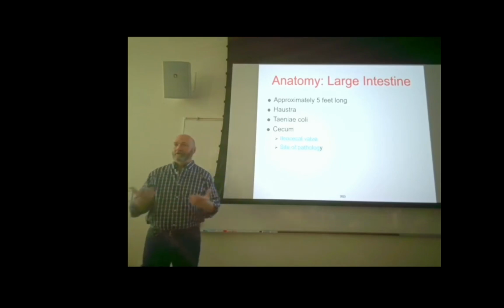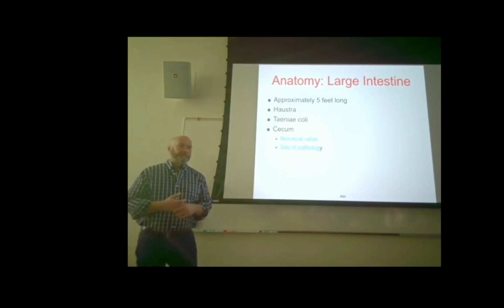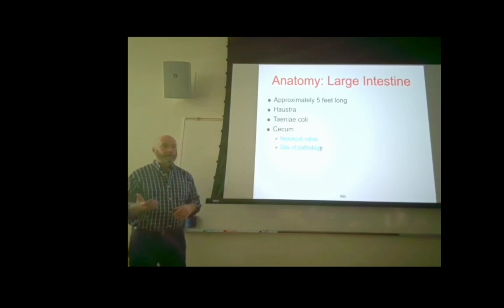Appendicitis can theoretically be diagnosed with some sort of colonic exam, like a gastrografin enema. I used to work in a hospital where it was routine. If a patient came in with suspected appendicitis, we would do a gastrografin exam. Now, why would we do gastrografin? What is gastrografin? It's iodinated, right? So why would we want to do gastrografin as opposed to barium? If it gets out of the body, it won't harden. Exactly. It can be reabsorbed by the body.